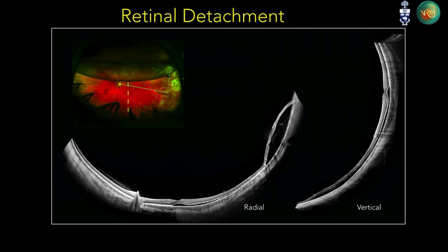We've opened a whole new frontier on managing these surgical patients, whereas you may not get an OCT on a patient with gas because the utility was probably low at that time with spectral domain. So here we can see obviously there's subretinal fluid and the patient's still recovering, actually was reducing over time, but there was still a small leak that was happening post-pneumatic retinopexy.